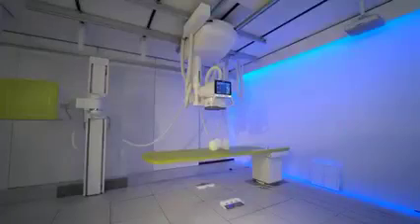And what is for the C90 a new feature and so unique on this user interface is that right now we can also open the camera that you saw earlier on the Eleva tube head as well inside the control room. Because how many times does it not happen that you positioned a patient in a perfect way? You moved away to release your X-ray and you are in the control room, but this patient has moved in the same time as well.